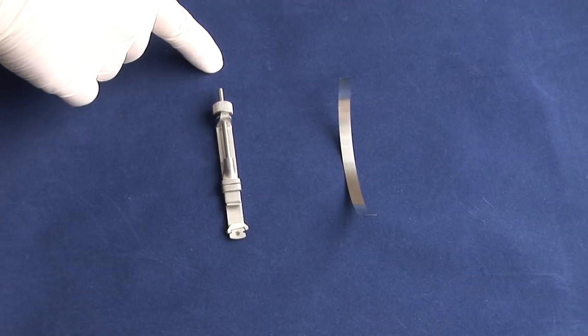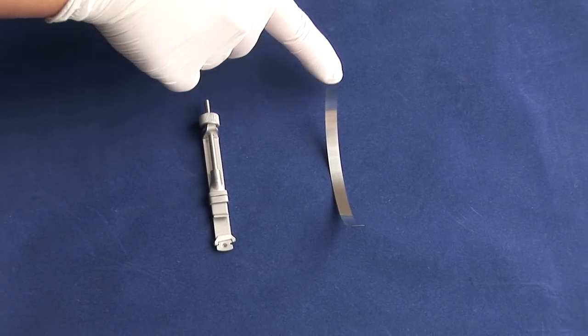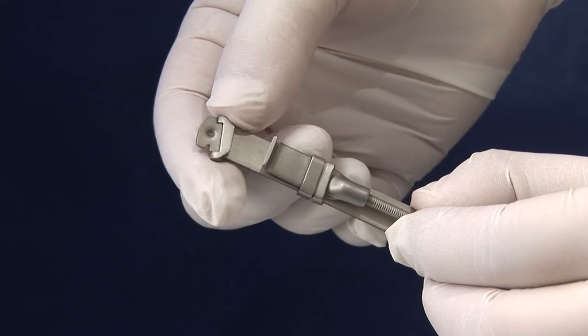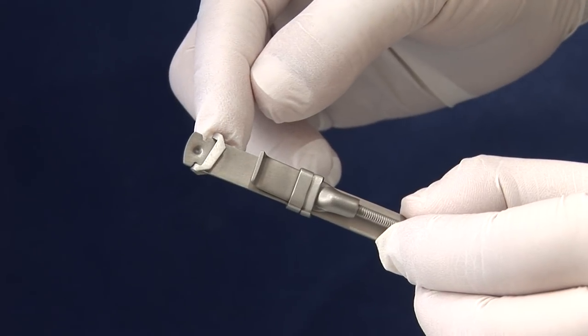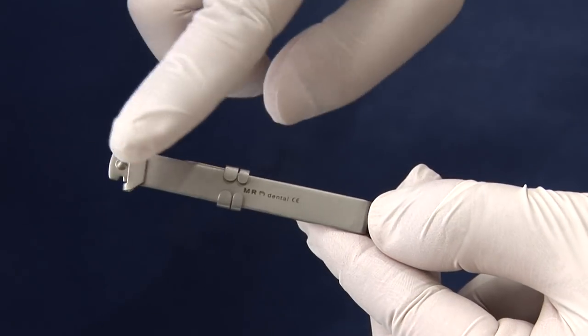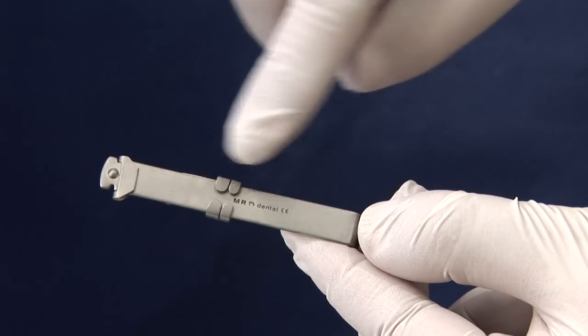This video will demonstrate how to prepare a matrix retainer and matrix band. On this side of the matrix retainer you will find the latch and the locks. The other side is flat and should face towards the cheek.